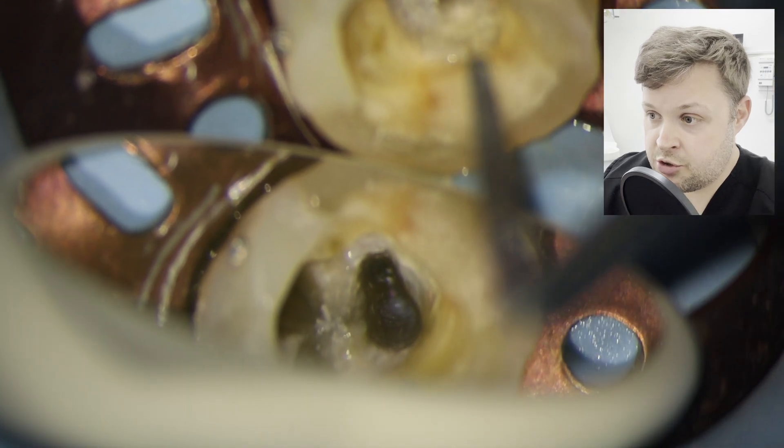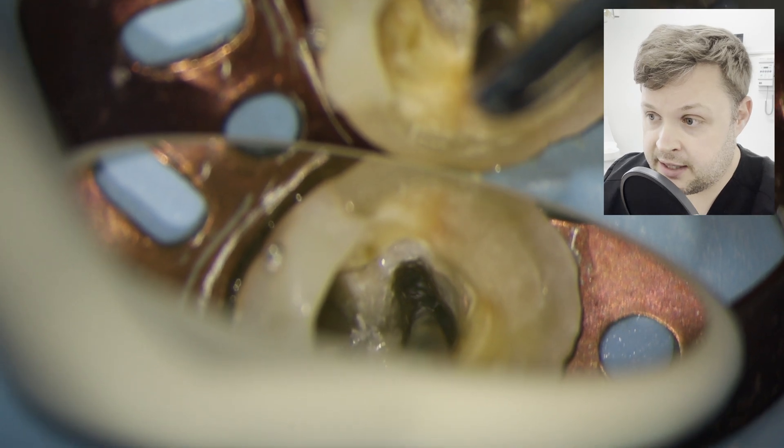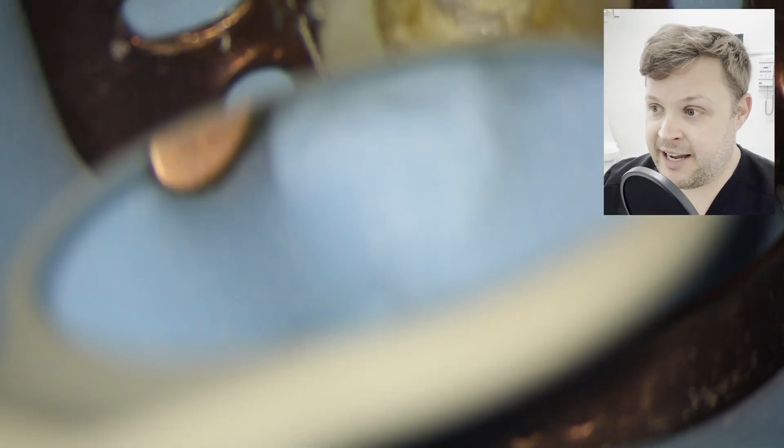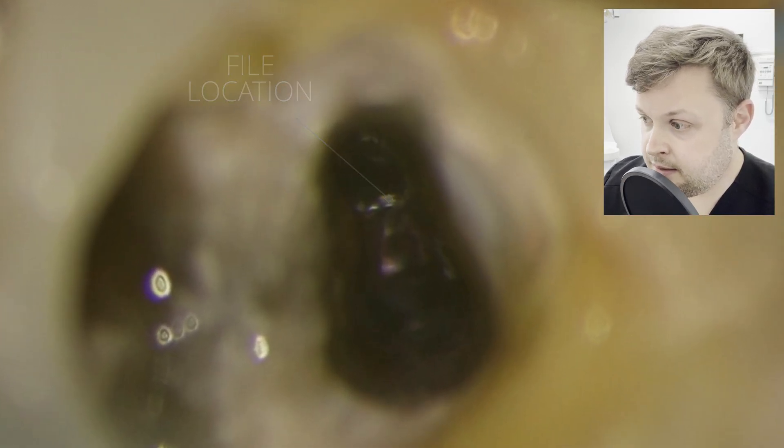I'm using the diamond tip to remove some of the dentin shelf that's holding this file in place. What I'm trying to do is open up the figure-of-eight pattern. Obviously the canal is getting wider, but that's a good compromise to remove the file — though making the canal wider can weaken the tooth. I put a little more irrigant down to visualize the file, then use a paper point to clear the remaining irrigant. The file is still in the same place.